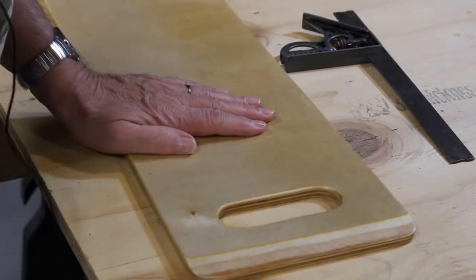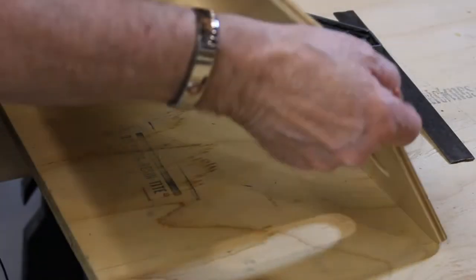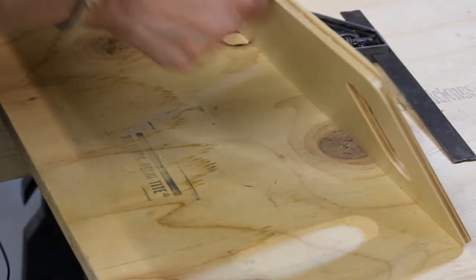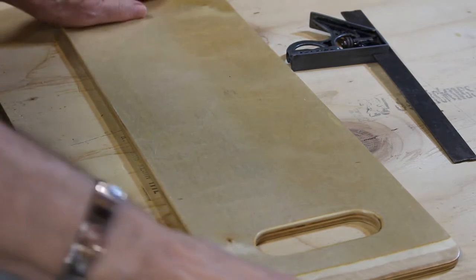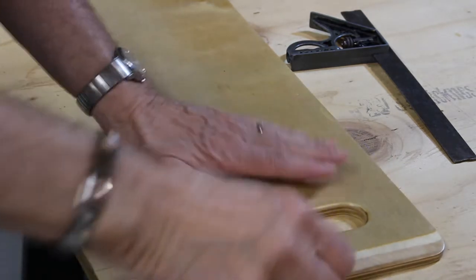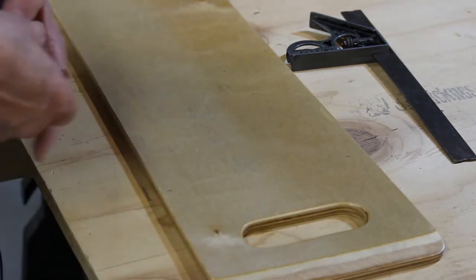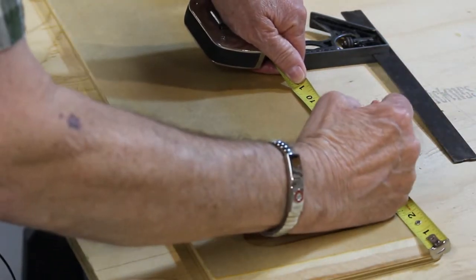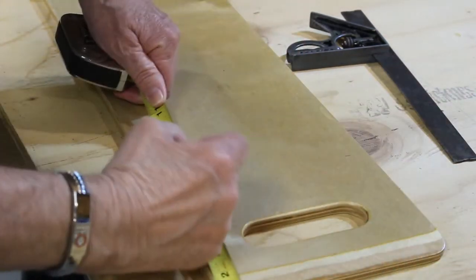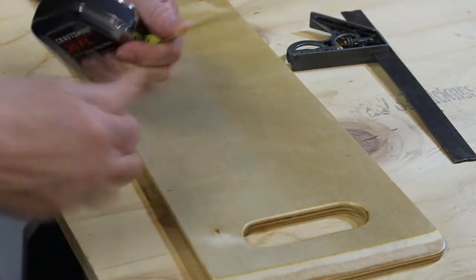I'm going to cut six inches off this board. I looked at the board at the edges and they're all nice. This end, the plies are a little nicer than on the other end. So I'm going to cut six inches off of this end and mark it.